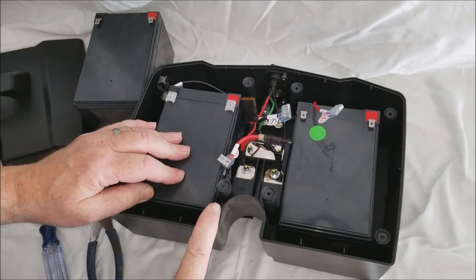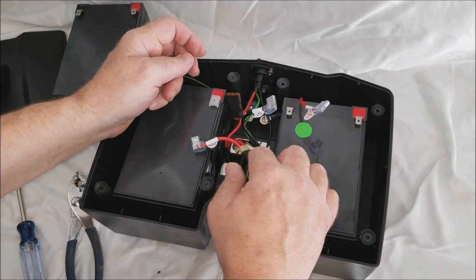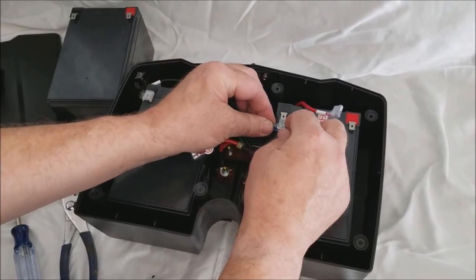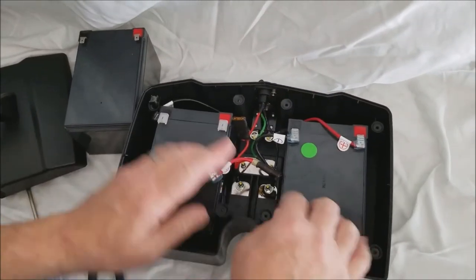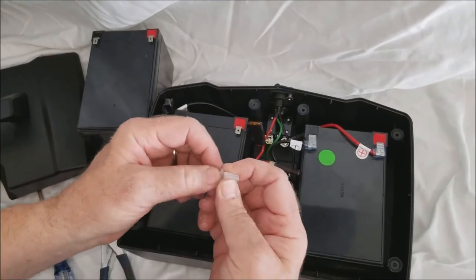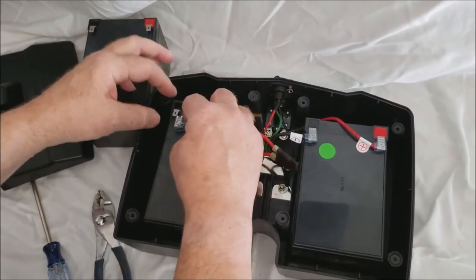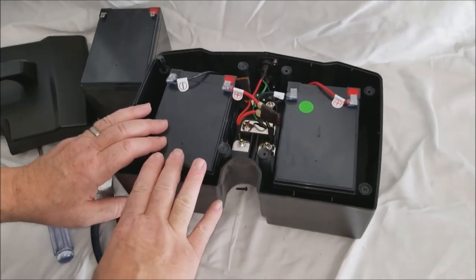It might be helpful for you to draw a picture of the wires as you took them off, but it's largely self-explanatory because the wires are pretty short. And you always want to match the colors. So this one is a black terminal. Here's a black wire. Put that on there. Red terminal, red wire. Some batteries will come with little plastic covers that you'll take off. Put the red connection here. And the black connection here. And that's it for the electrical piece of replacing the batteries.